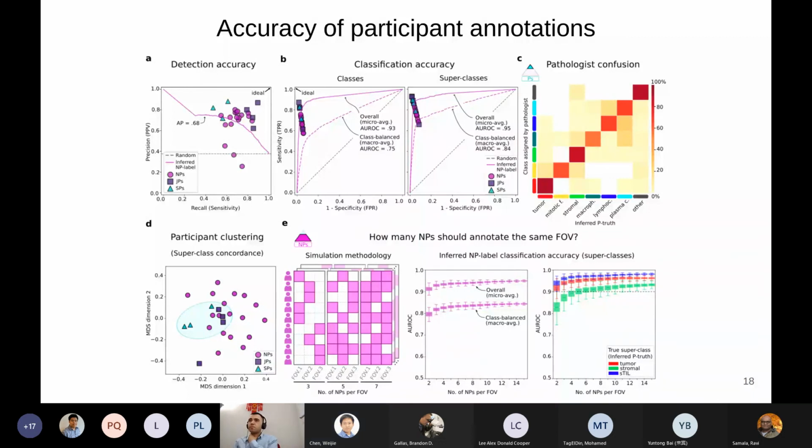And what's the sample size here, roughly? Here, this is our multi-rater data. So 1,400 unique nuclei. Of course, in terms of number of annotations, that's a lot. I think it's around 100,000. But unique nuclei after clustering, that's about 1,400 or so for this multi-rater data. Of course, the single rater is much larger.